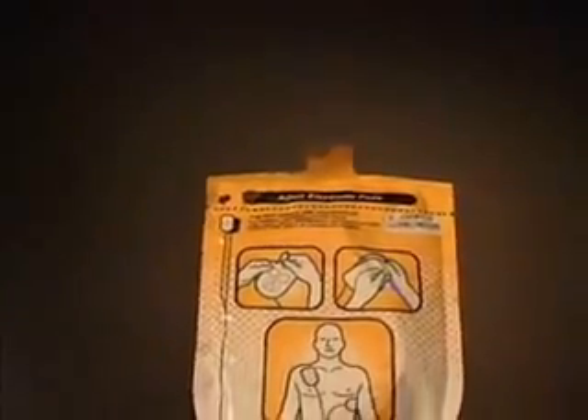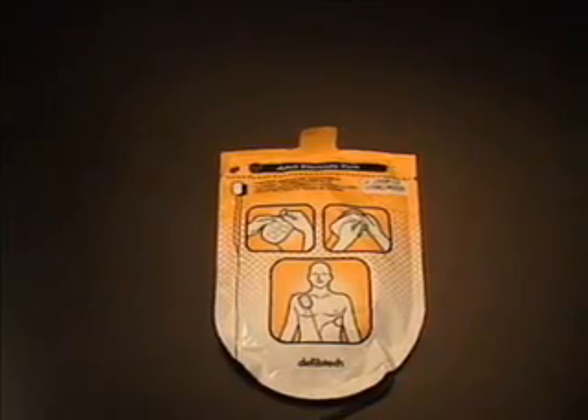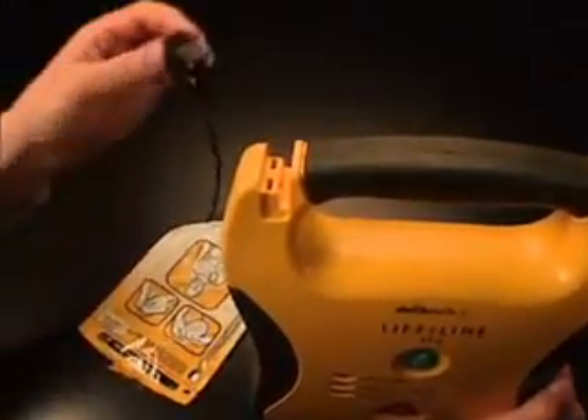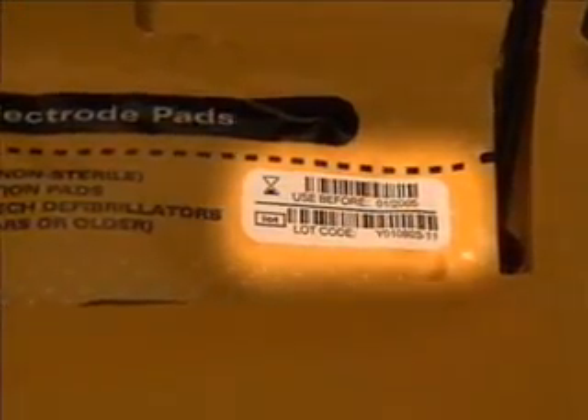The defibrillation pads are sealed in a single-use package. The package has quick-use instructions on how to use the pads. Do not open the package until the pads are required for use. The pads are connected to the Lifeline AED using the pad connector. To connect the pads to the AED, insert the connector into the slot in the upper corner of the unit. Note that the connector is designed to only go in one direction. Once connected, the pad package should be stored in the holder on the back of the unit so that the pad expiration date can easily be seen. Pads past their expiration date should be replaced as soon as possible. The pad cable should be pressed into the slot in the back of the AED.